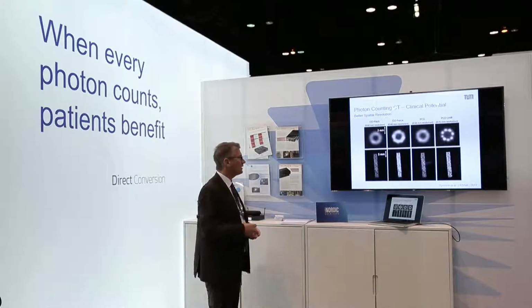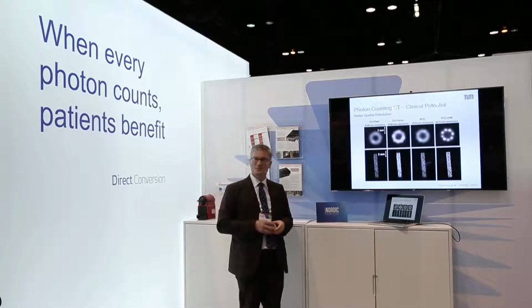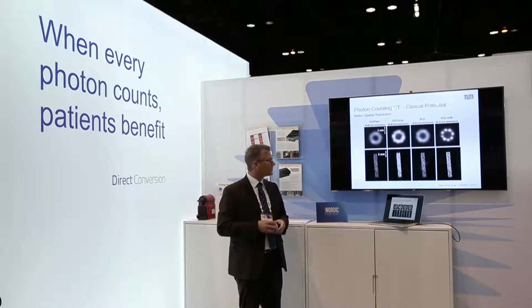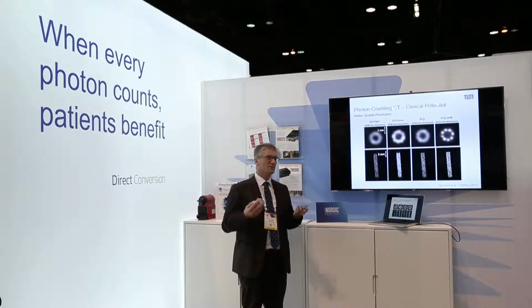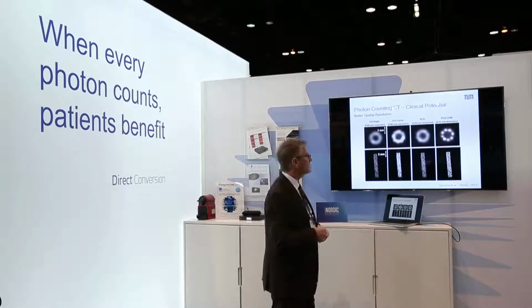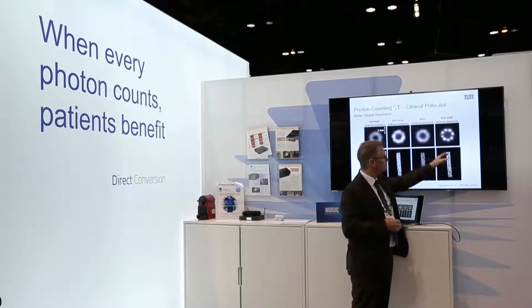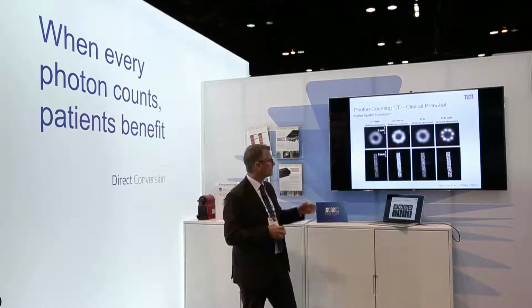Now, finally, if we just leave these colored images away for a second, then people have also investigated simply the fact that these photon counting detectors come with a higher resolution. Because the pixels are typically small, you can now, for example, think about visualizing stents, as done here in this prototypical experiment, much better than in a normal system.